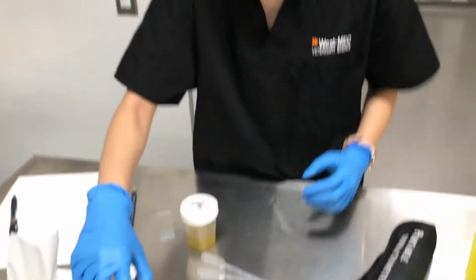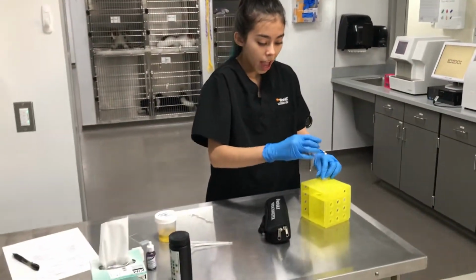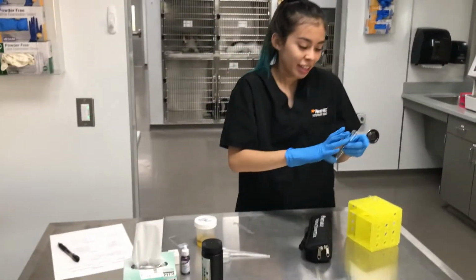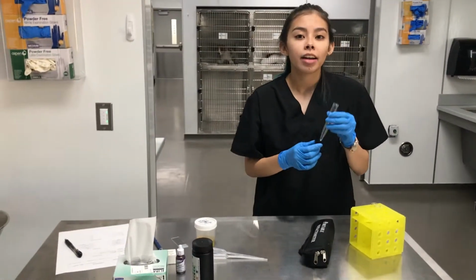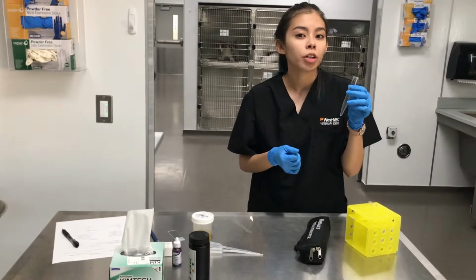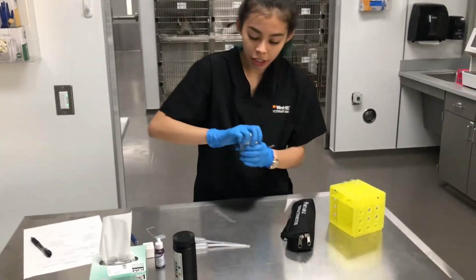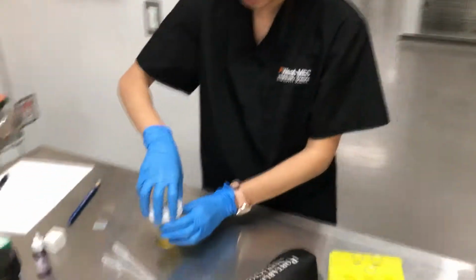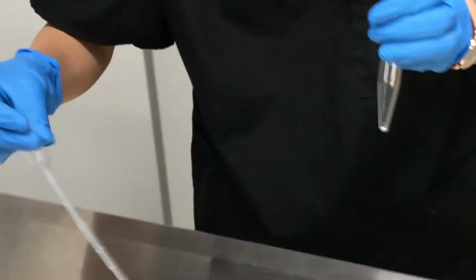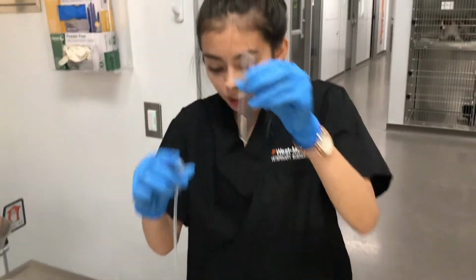And the next step for this urinalysis will be to add a urine sample into the test tube with tapered ends, also known as conical tubes. So I will collect this urine with a pipette. So taking my conical tube and pipette, I will add urine up until this line right here.